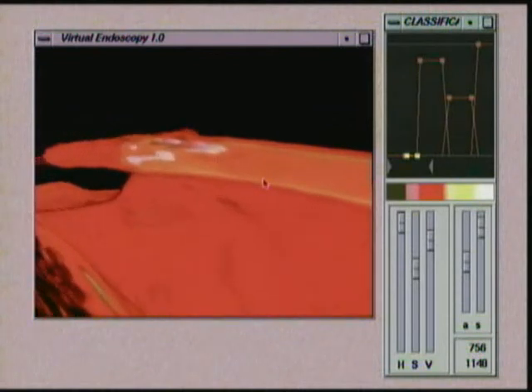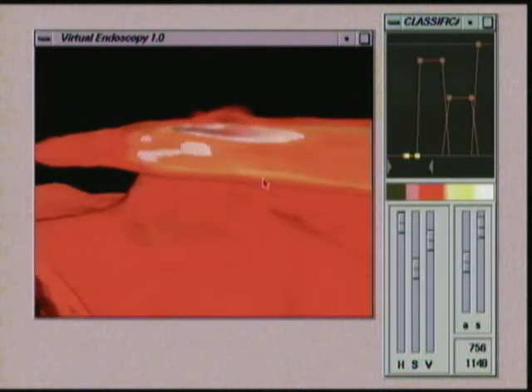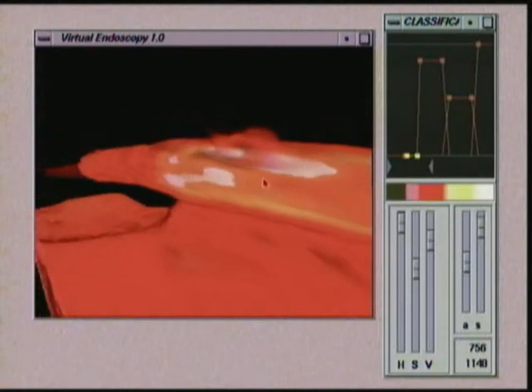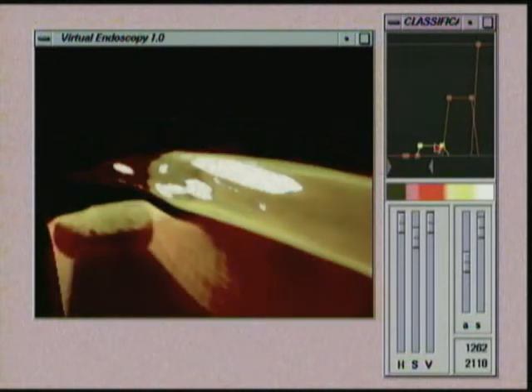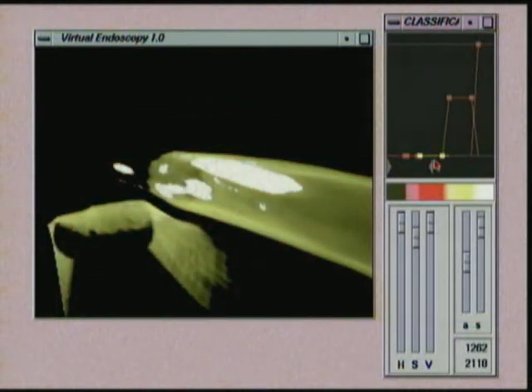The procedure allowed us to identify the protrusion of the atherosclerotic plaque narrowing the lumen, now extruded from the latter by the correct stent placement. Here, the plaques have been colored in white.